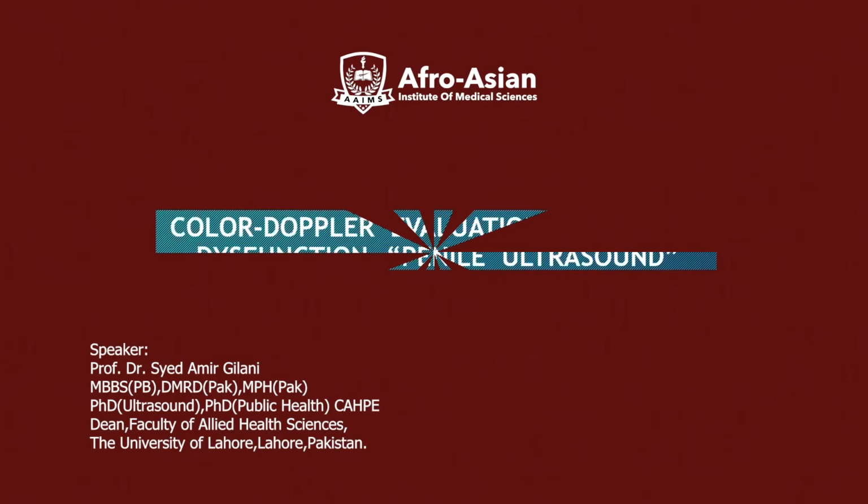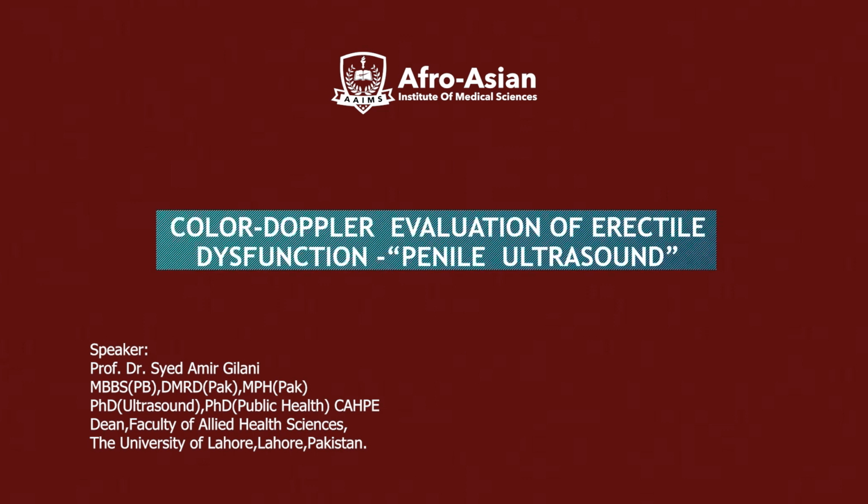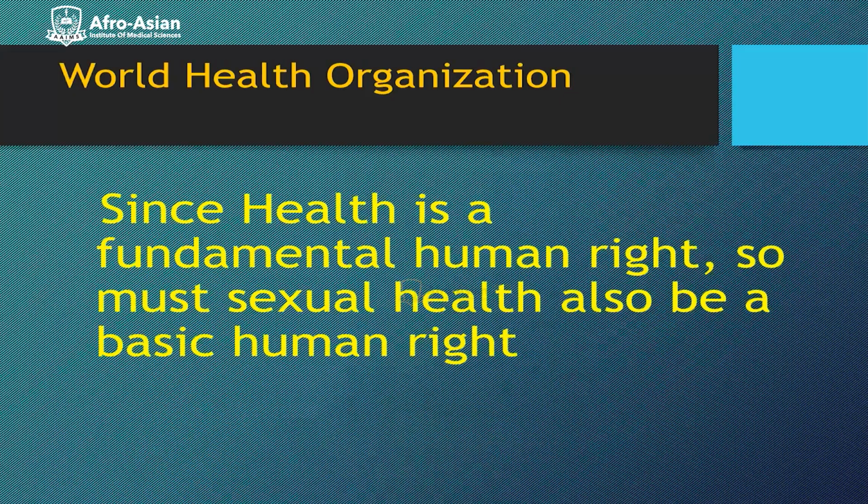Color Doppler evaluation of erectile dysfunction, which is the penile ultrasound. The World Health Organization says that since health is a fundamental human right, so must sexual health also be a basic human right.